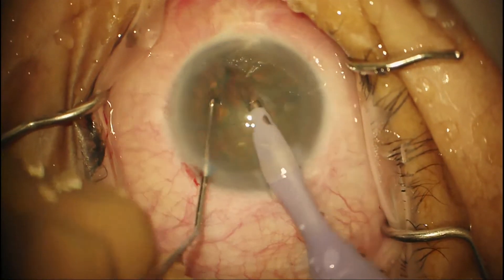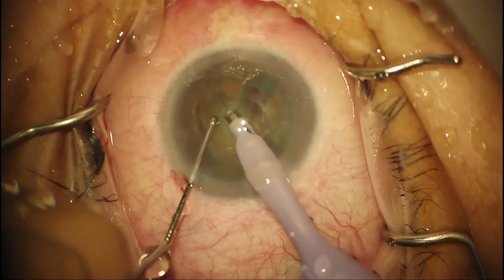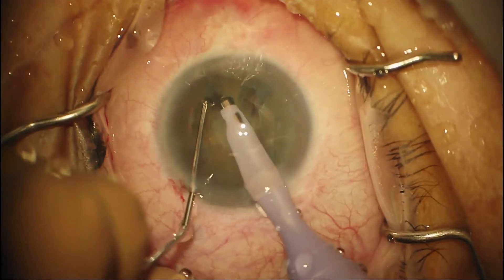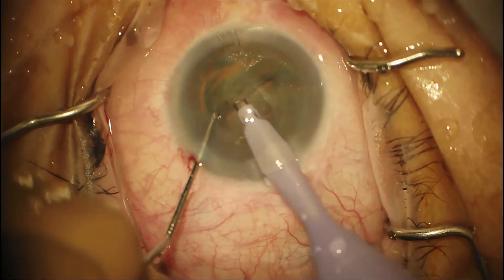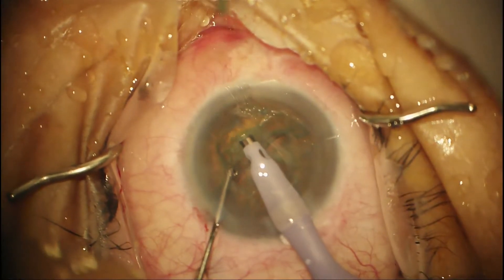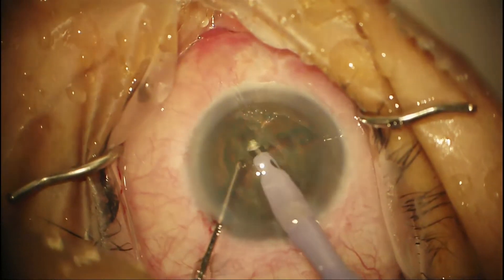We're going to make all four quadrants. After that first groove, you have a very good idea of what depth you should be at. There I could see it was almost already fractured so you don't even have to go deep at all. We're going to go make the last two quadrants. You can take quadrants out as you go. I think I'm demonstrating a classic divide and conquer technique. It's easier to do that last hemi-nucleus with the other quadrants still in the eye — otherwise it has a tendency to move around on you.